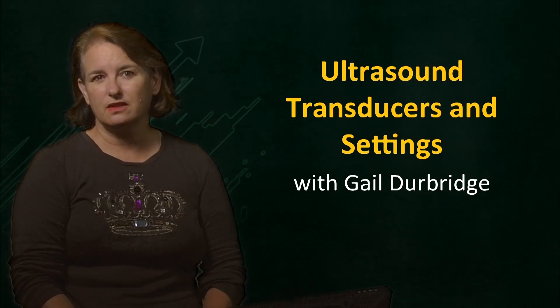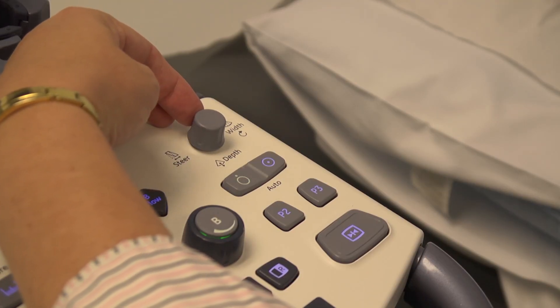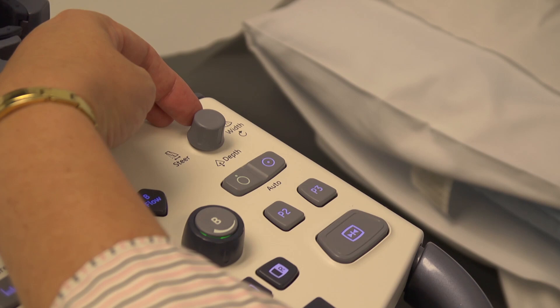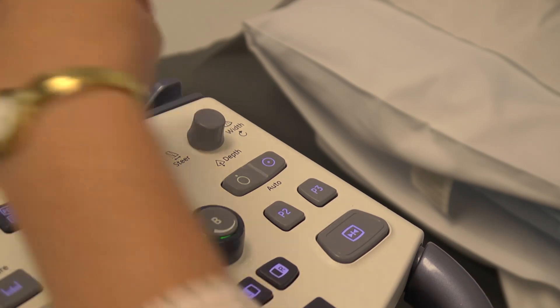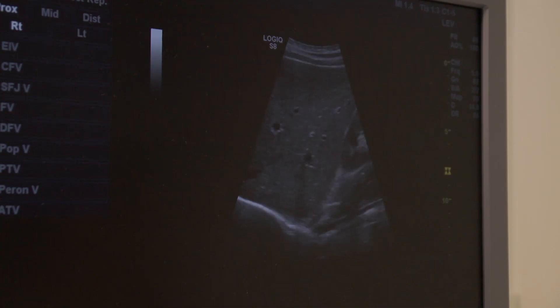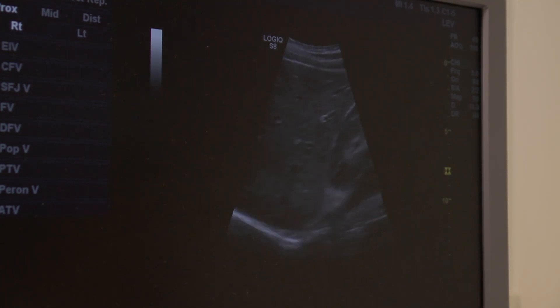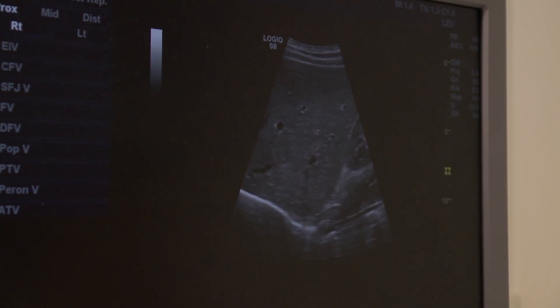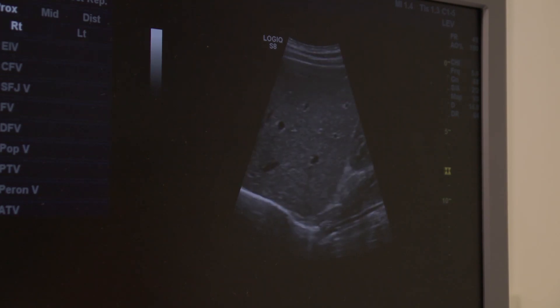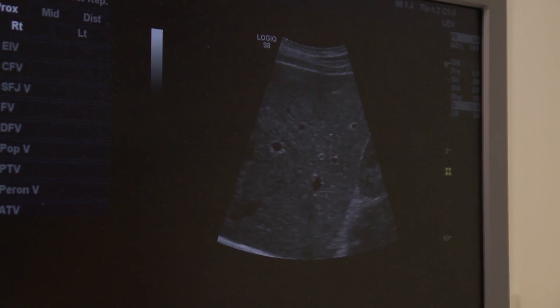Once we have selected the transducer we must then decide what depth of tissue we wish to display. We want the part of anatomy that we will be looking at to fill the entire screen. You can see here that we start by looking at the liver. With a large field of view there is a bright band at the back which is the diaphragm, and the right kidney can be seen sitting next to the liver.